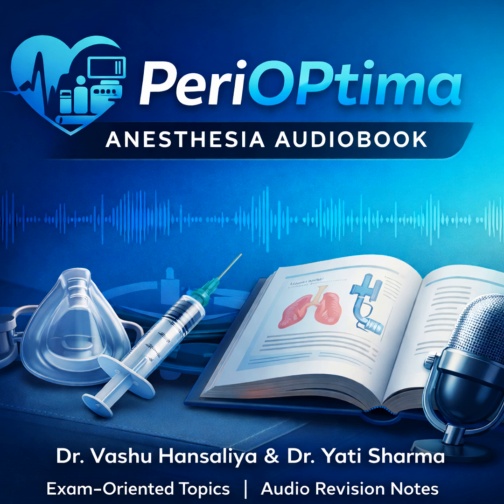Let's talk about Section 6. Monitoring during mechanical ventilation. The ventilator screen is full of loops and numbers. It can look like the cockpit of a fighter jet. Focus on pressure and volume. There are 2 key pressures you must distinguish: peak inspiratory pressure, or PIP, and plateau pressure, P-plat.